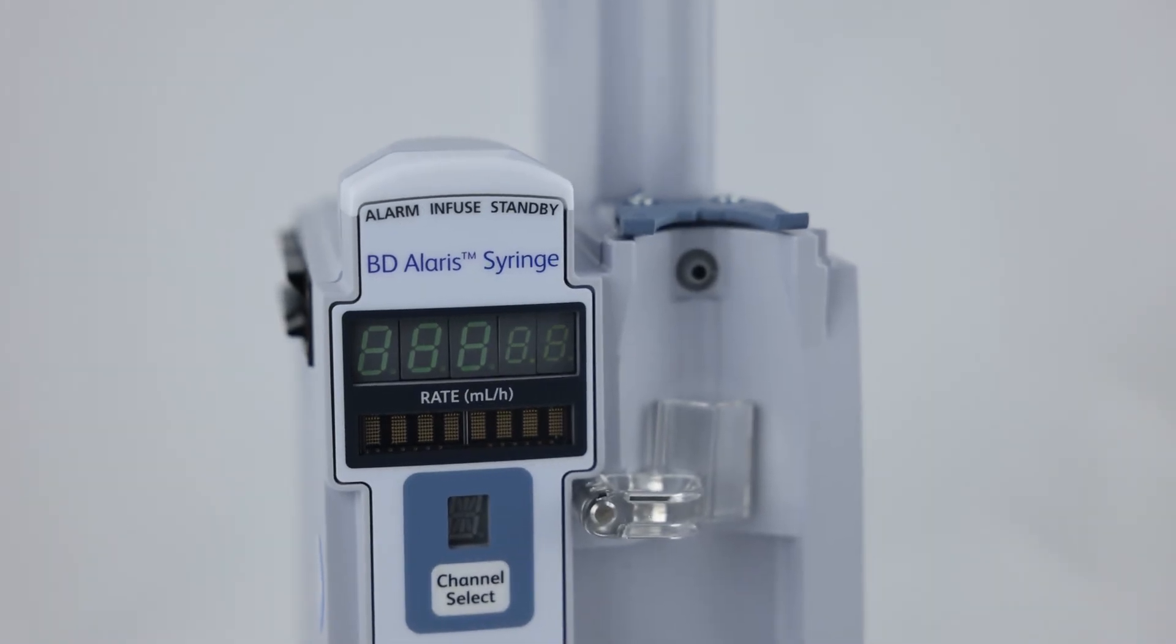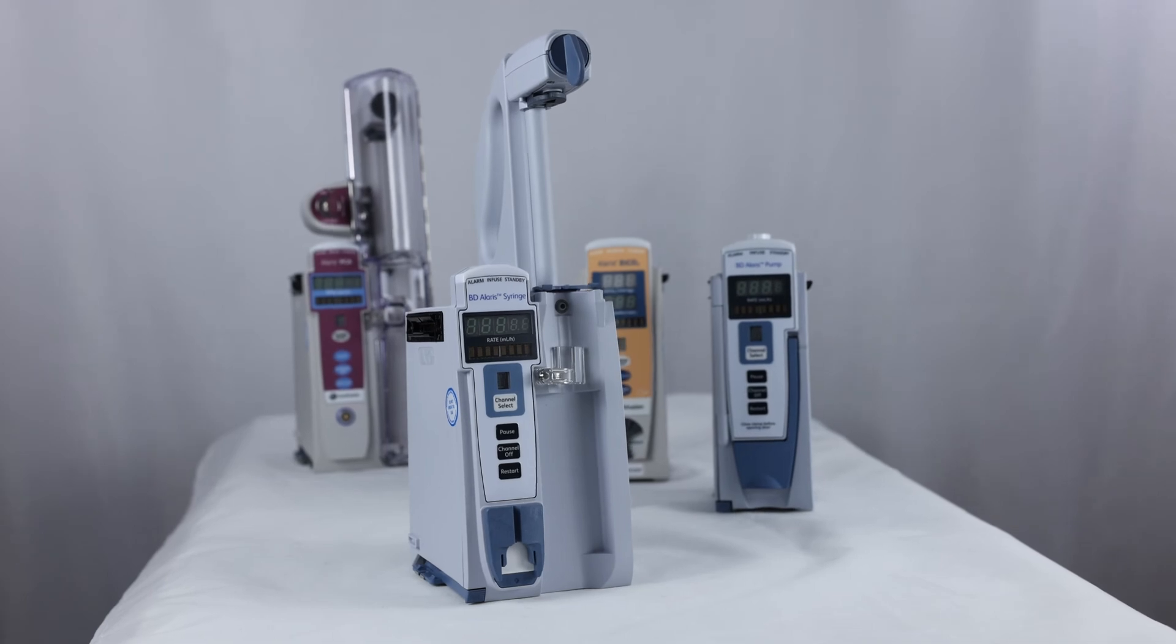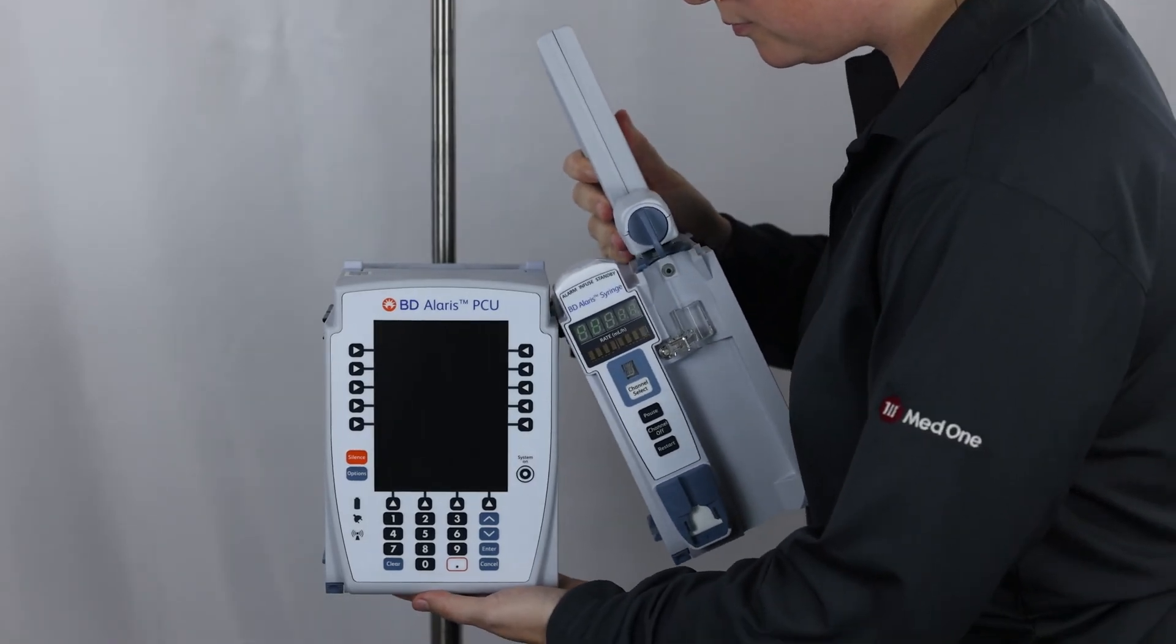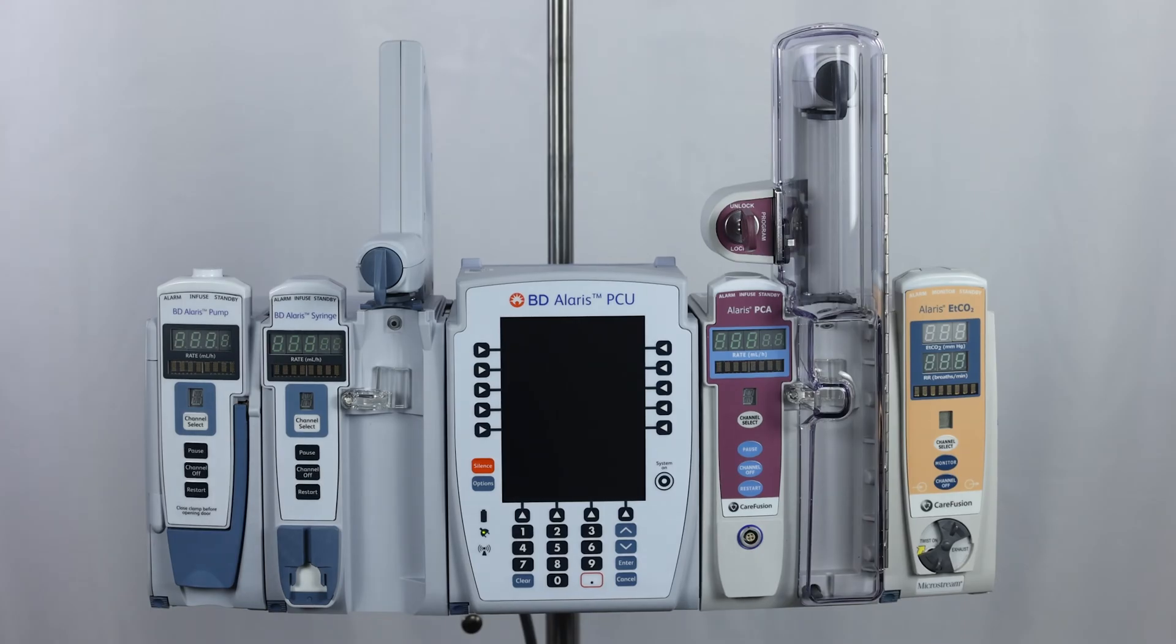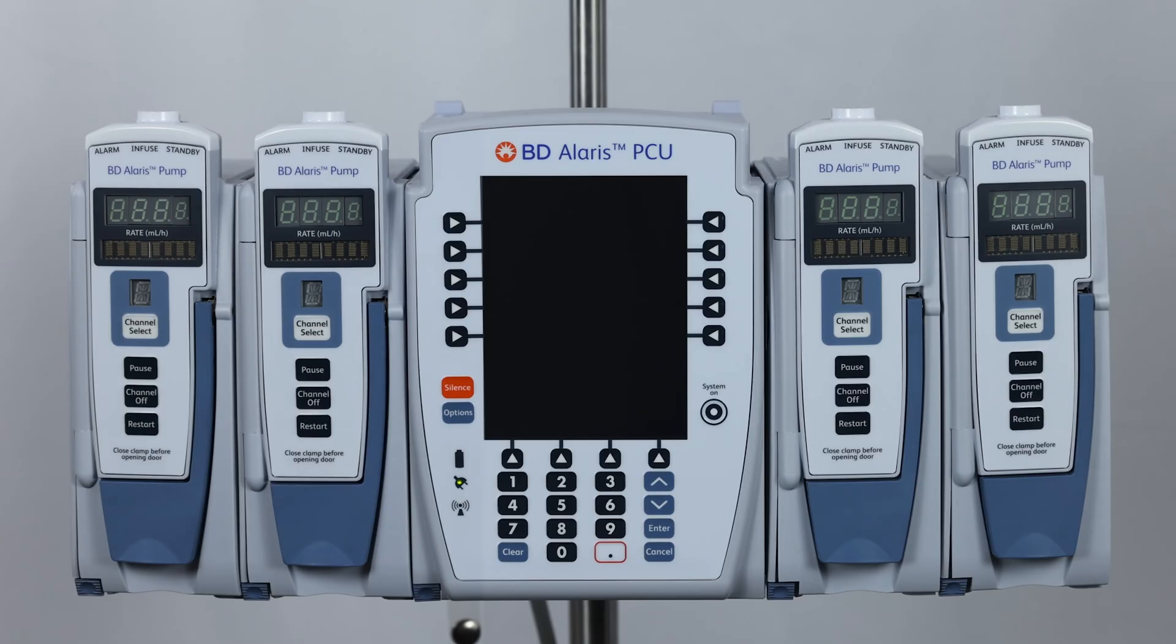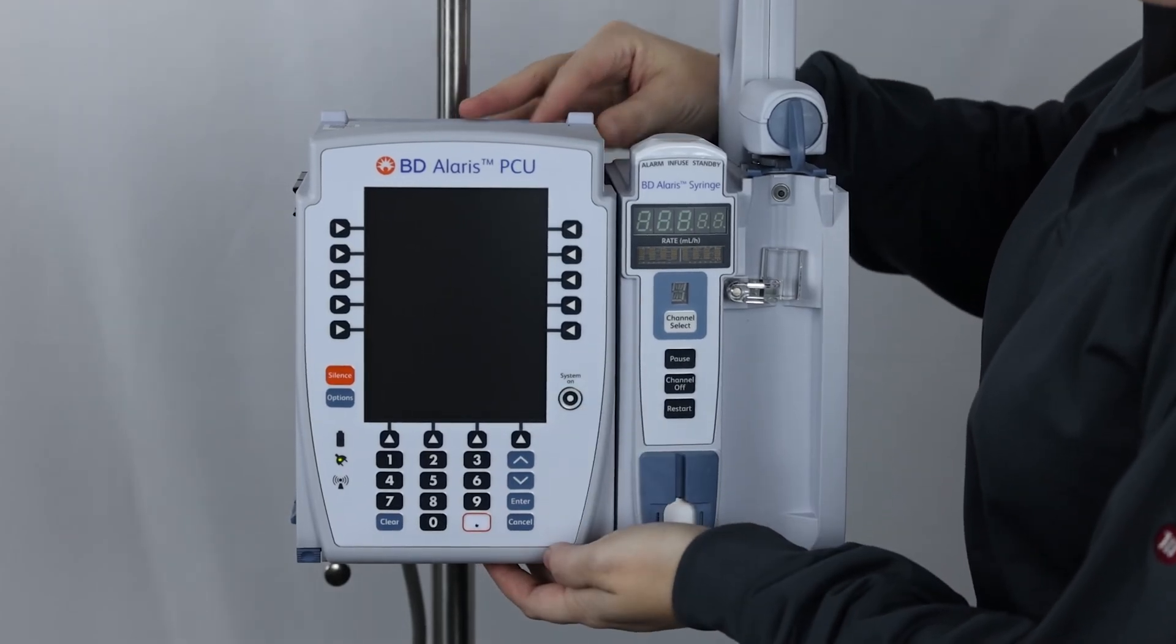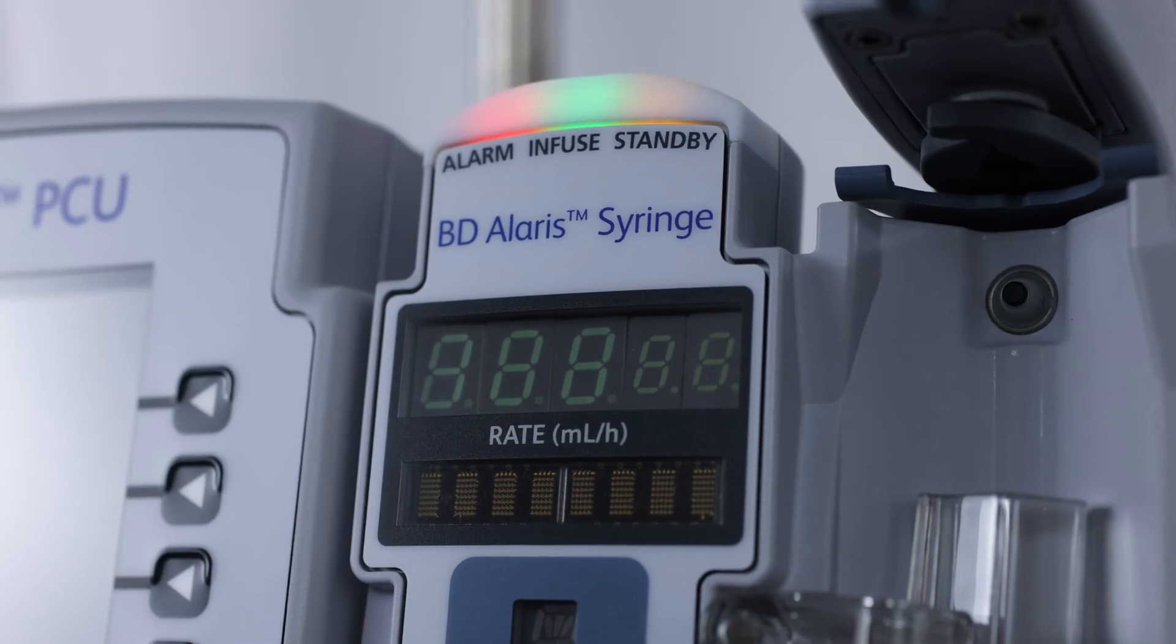The Alaris 8110 is the syringe pump module that is part of the modular Alaris system by BD. In order to use the 8110 module, it must be connected to the 8015 point of care unit or PCU. Up to four modules of any combination can be attached to the PCU. The Alaris system is powered through a wall outlet but has an internal battery life of six hours should a power outage prevent the pump from being plugged in.